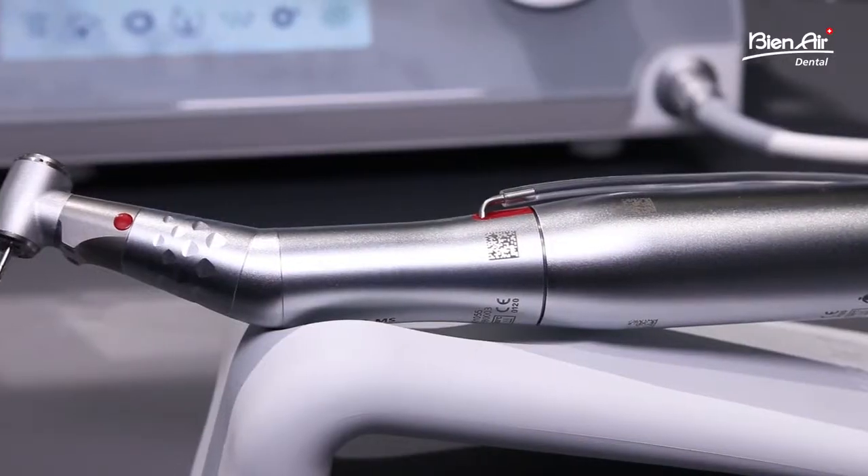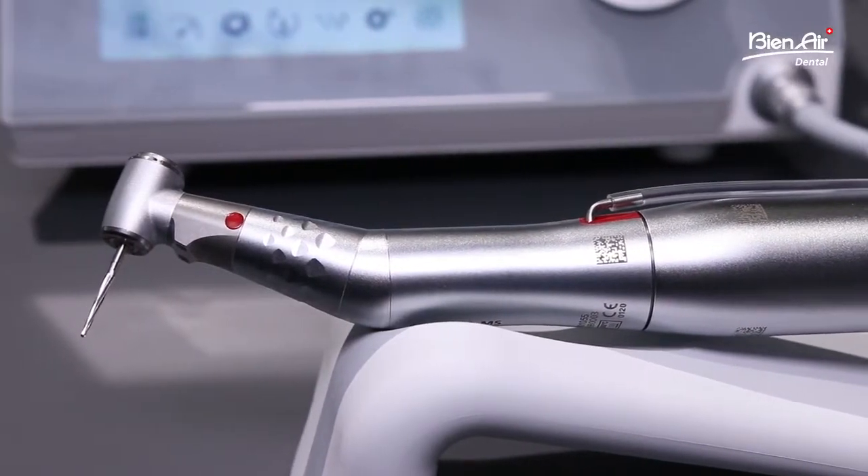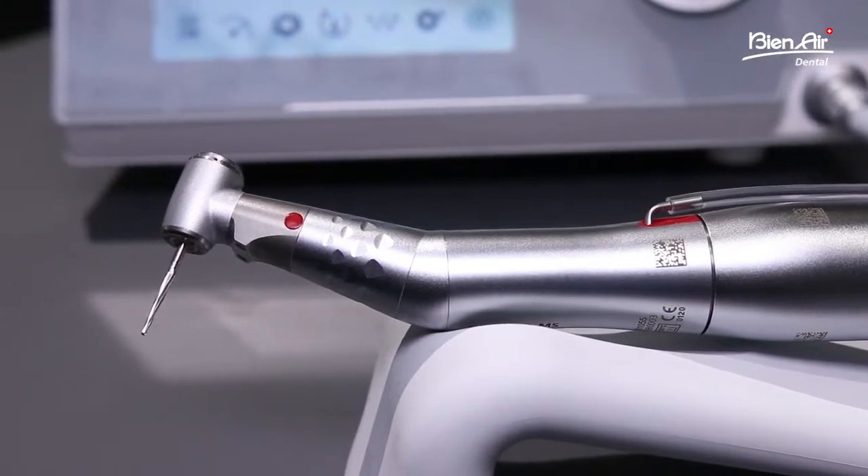It can also be used with a new handpiece 1:2.5, which enables you to do maxillofacial and oral surgery with a contra angle, giving you a better field of view so you can actually see where you're working, while maintaining the same force as a straight surgical handpiece. In combination with an implant handpiece 1:20, you will reach the maximum torque of this machine.